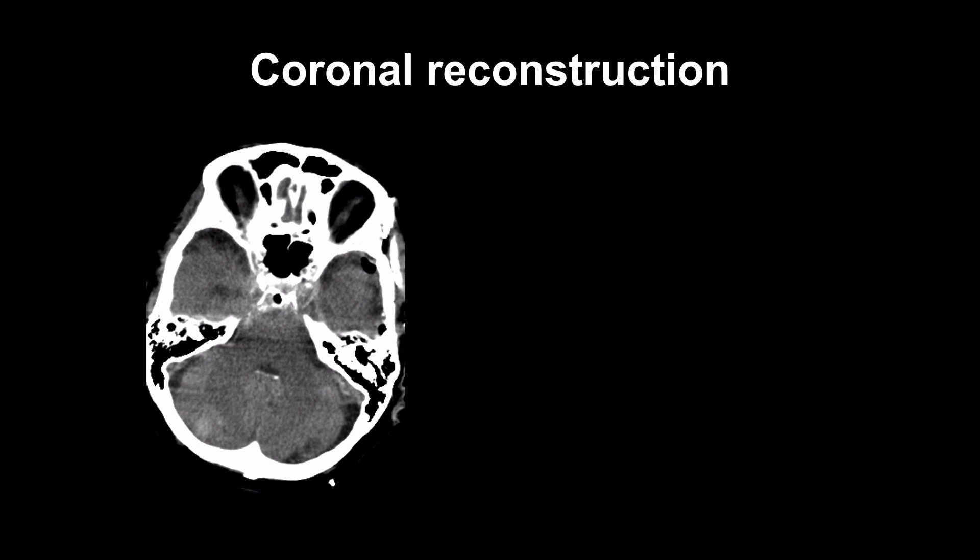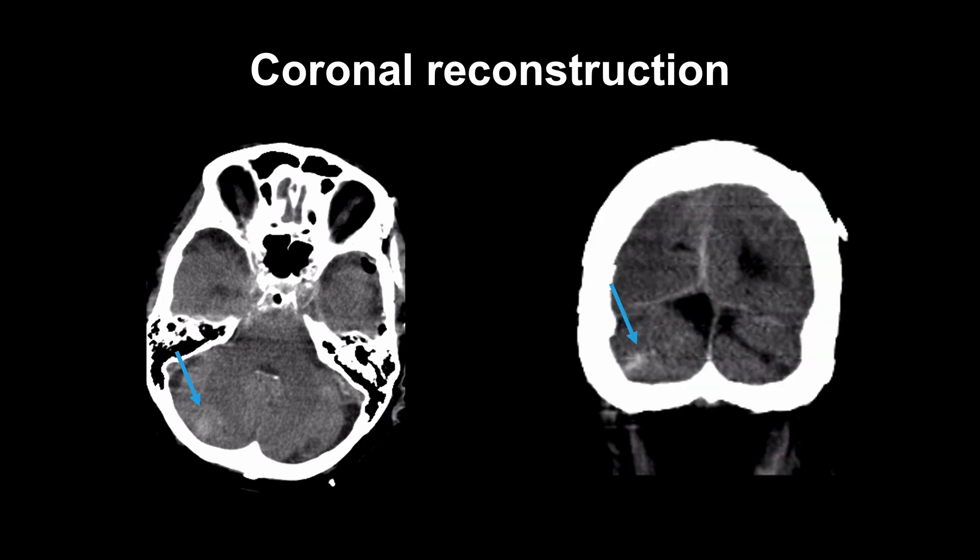We always view CT on axial images, but in patients with suspected trauma or subarachnoid hemorrhage, reconstructions in coronal and sagittal views can be very helpful for the detection of the hemorrhage as well as assigning it to the correct compartment. In this case, the high attenuation evident on CT in the right cerebellar hemisphere could be parenchymal, but its location in the subarachnoid space is much easier to establish when the scan is displayed as a coronal reconstruction.